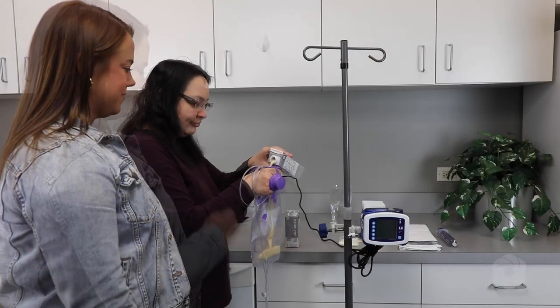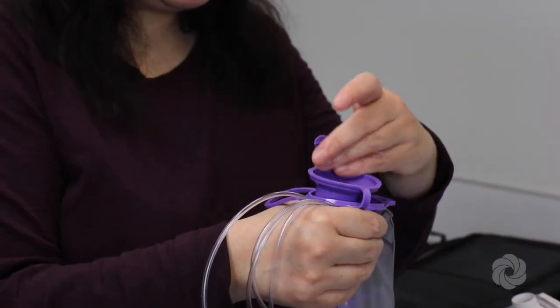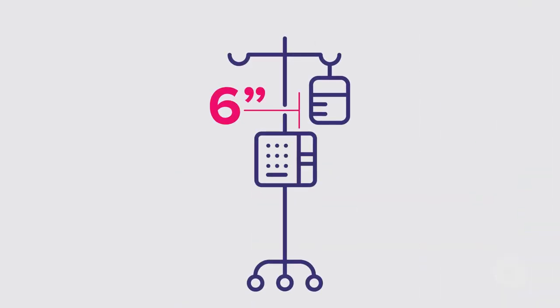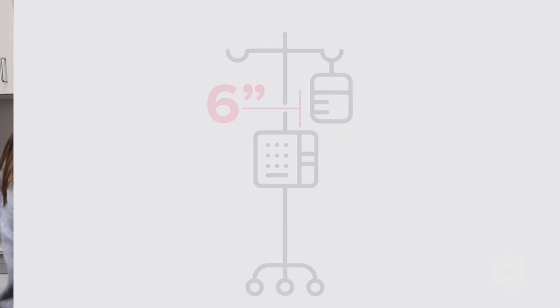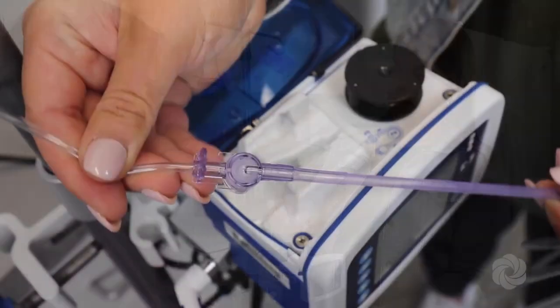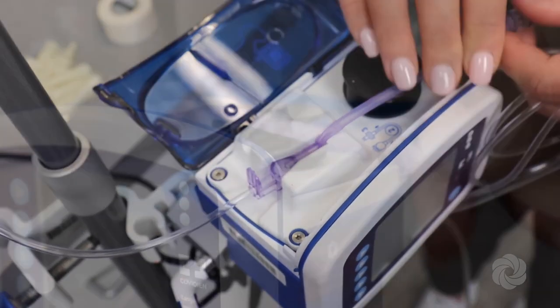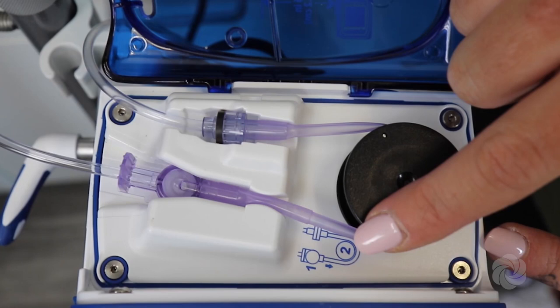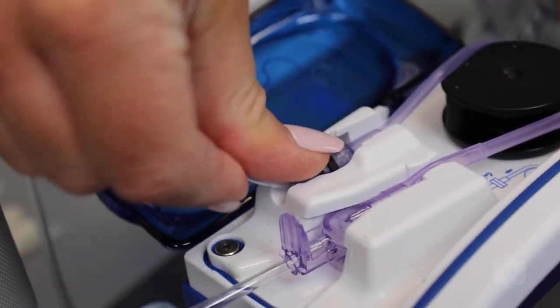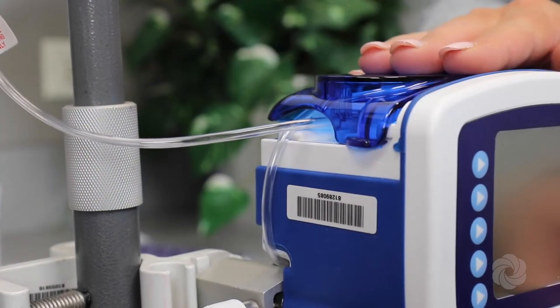Best practice is to keep the pump plugged in when not in use. Hold the feeding bag upright and pour in the formula. Securely close the lid on the feeding bag by pressing down in the middle of the cap. The top of the formula in the bag should be 6 inches above the pump. Hang the feeding bag on the hook at the top of the pole. Open the blue door on the pump. Locate the clear tab on the tubing and set it into the pump facing upwards. Wrap the tubing around the pump wheel per the diagram under the door of the pump. Ensure that the tubing exits the side of the pump and then close the blue door.